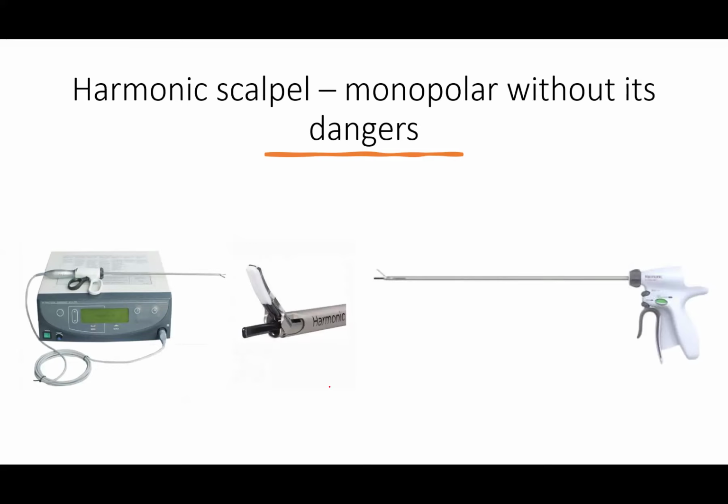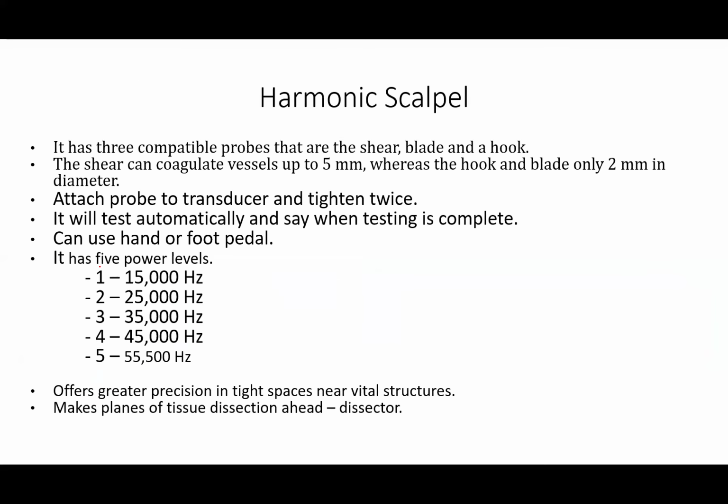You can see why the use of all these advanced instruments is very expensive. You have to be replacing this handle. It is disposable. If used for a certain number of cases, you have to change the handle.